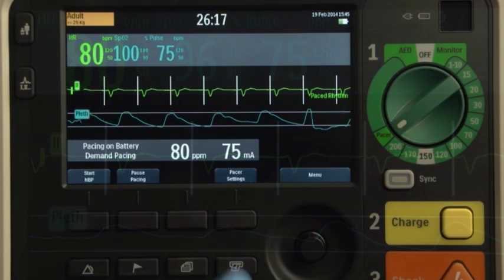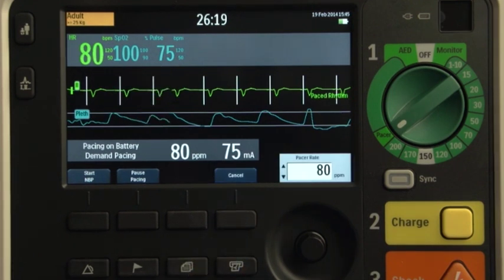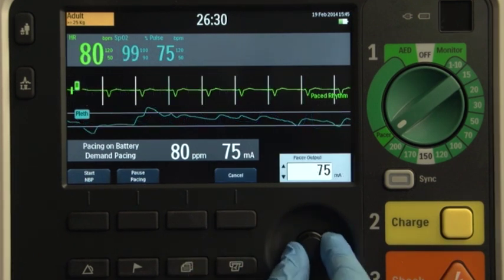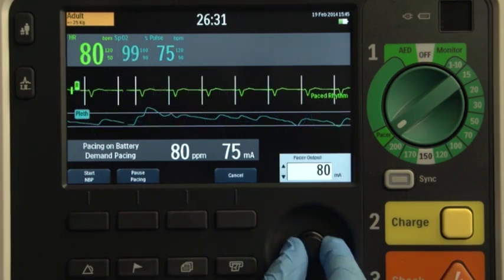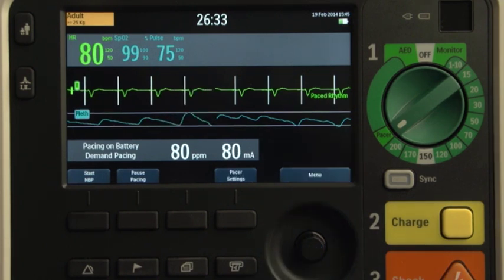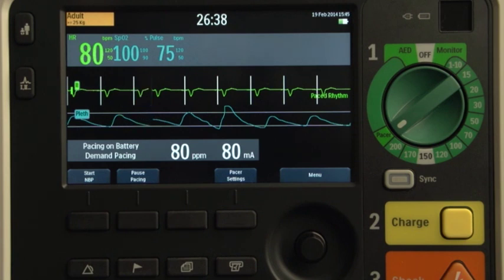Press the pacer settings soft key. Use the smart select knob to increase the output until mechanical capture occurs by assessing for a peripheral pulse. Increase the output 5 to 10 milliamps above the level that capture was obtained.